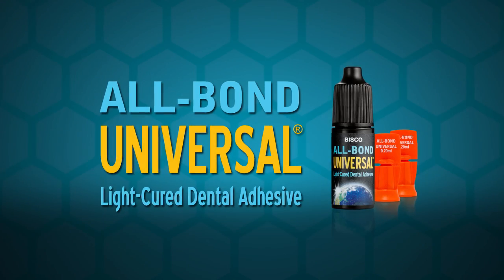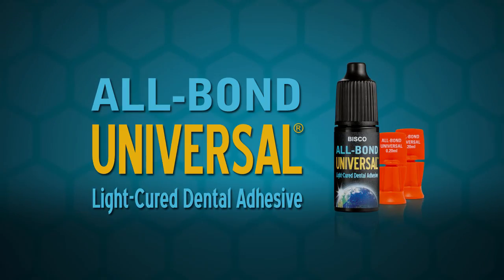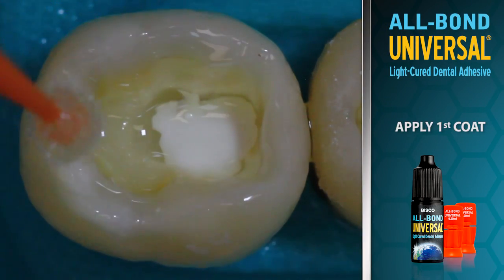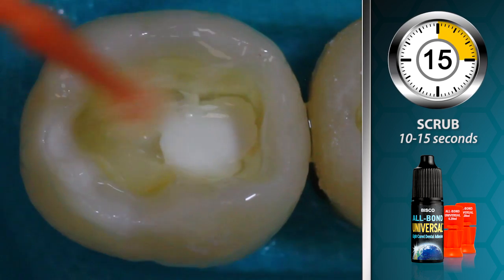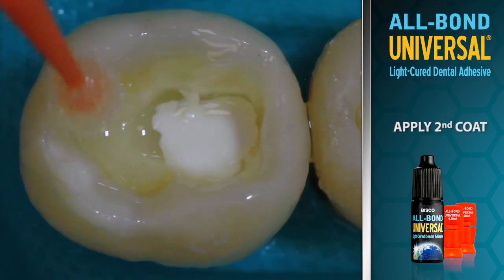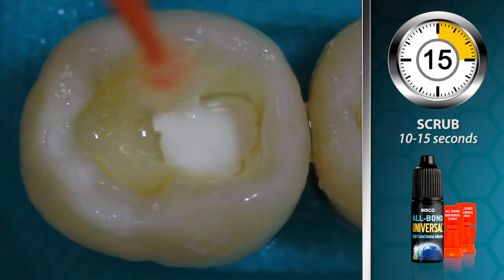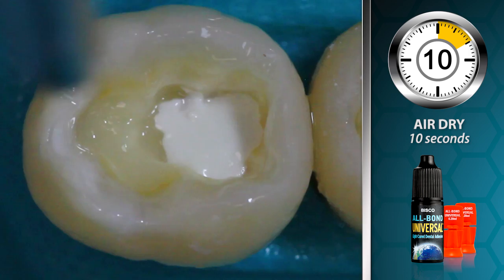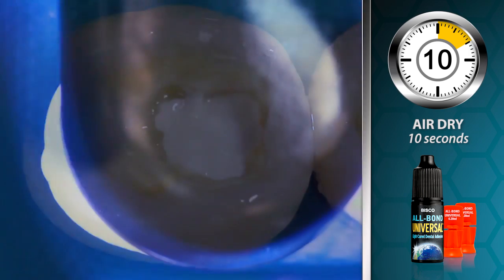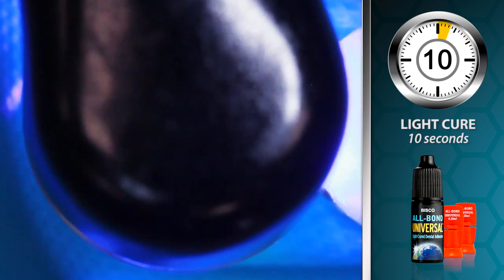All Bond Universal is a single bottle bonding agent used for all bonding procedures. Apply a coat of All Bond Universal to both enamel and dentin and scrub for 10 to 15 seconds. Apply a second coat to both enamel and dentin and scrub for 10 to 15 seconds. Air dry for 10 seconds to remove the solvent, then light cure for 10 seconds and proceed with composite placement.